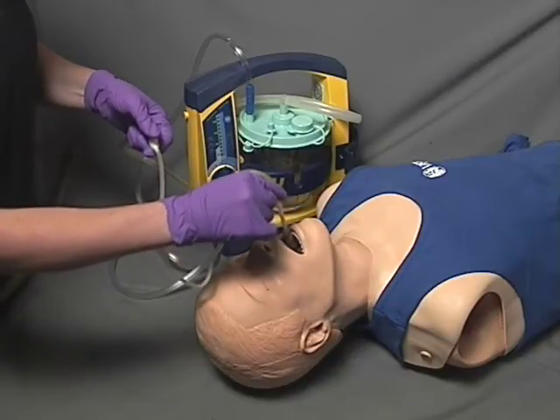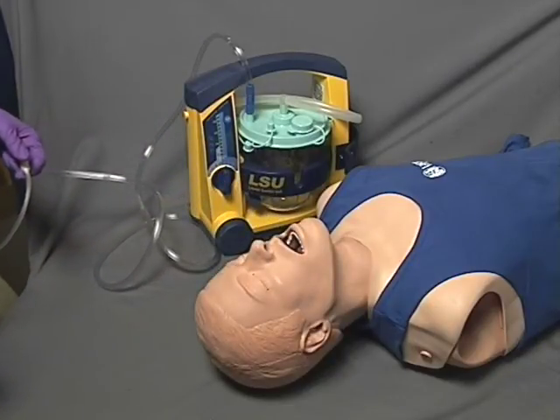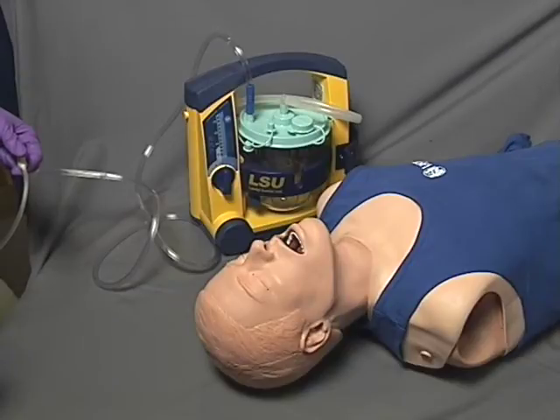Keep suction applied and remove the suction catheter. Once completed, check for adequate air exchange. It may be necessary to suction multiple times.